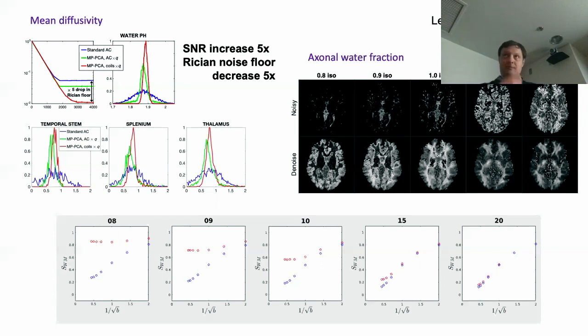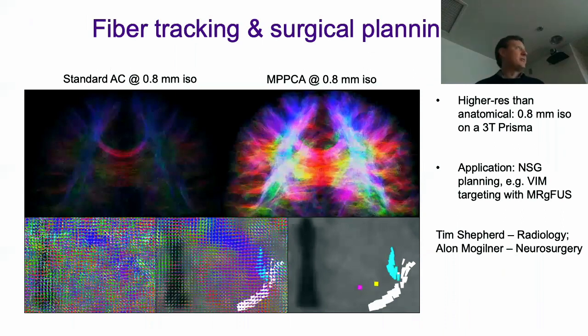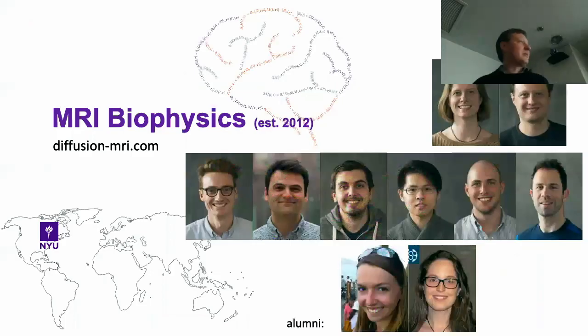So how do you determine the size of the square that you use for that? It's spatial, and it's trial and error. And when you accelerate, when the voxel folds, and the phase is different for different things? Yes, so we unwind the phases. There's some magic going on. When we unwind phases, we make sure that the number of degrees of freedom is as small as possible. And there is a dependence on the kernel size of this. Anyway, you can do fiber tracking again to improve it, and so on.